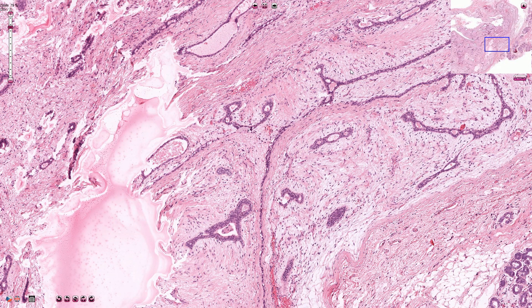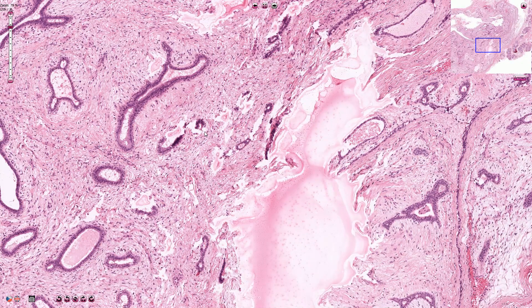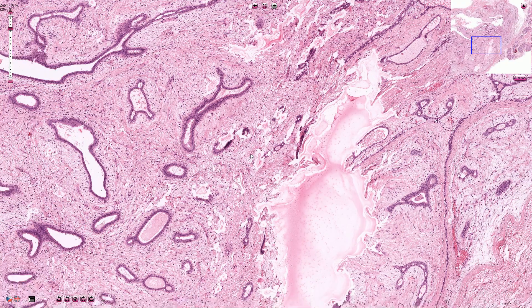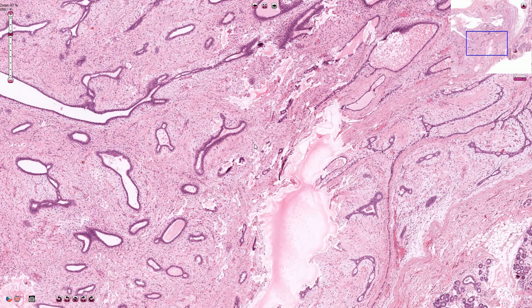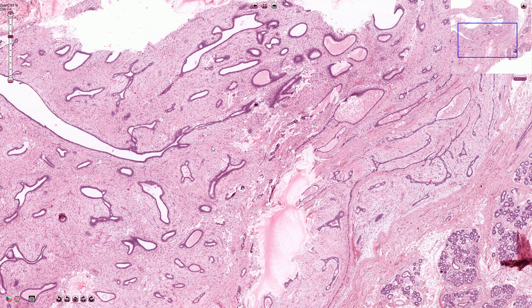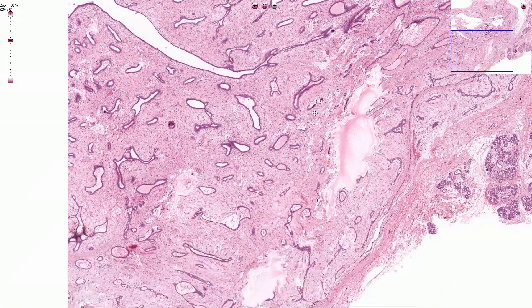The second pattern is called the pericanalicular pattern, and it can be seen in this part of the slide where the stroma surrounds the glandular elements without compression, without distortion, and without linear arrangement. Both of these terms are purely descriptive and do not have any deeper meaning or prognostic significance. We should be familiar with them because they are useful for describing the structures we see when diagnosing fibroadenoma.